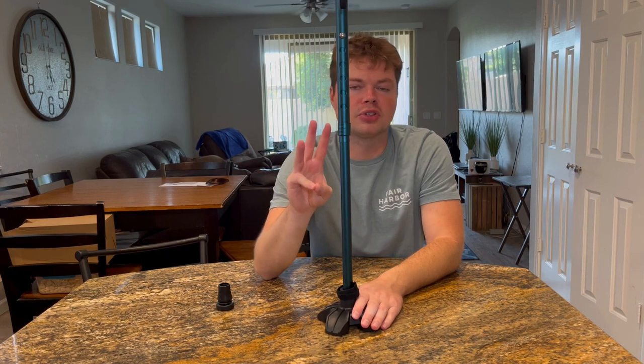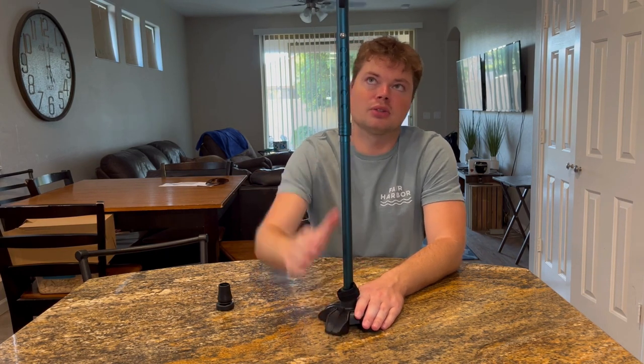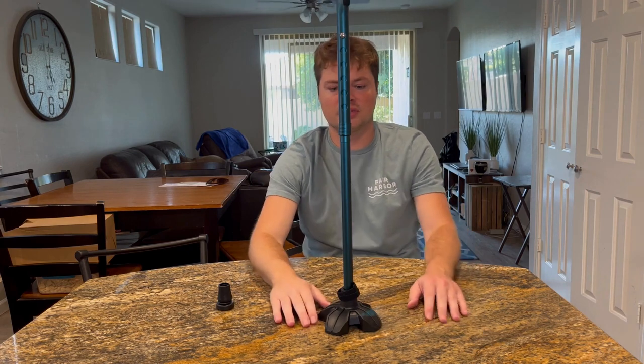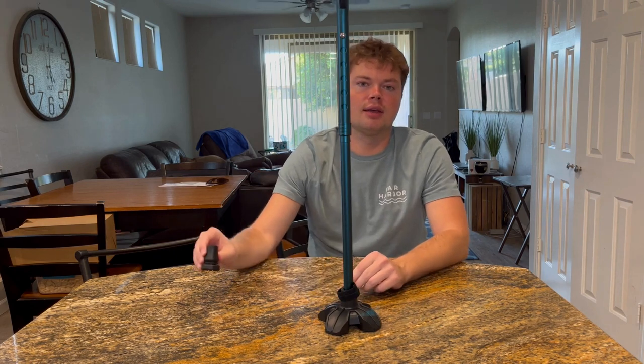I was looking in the FAQs and there are three questions that were being asked over and over, so I'm going to answer those. The first one is how much weight can this hold? It can hold 250 pounds. The same question I saw is can it stand by itself — so here you go, it can stand by itself. It comes with two different joints and both of them allow the cane to stand by itself.